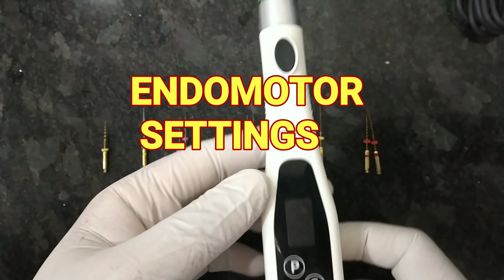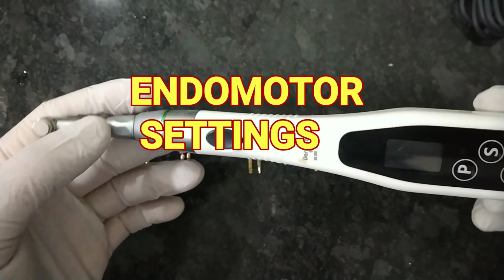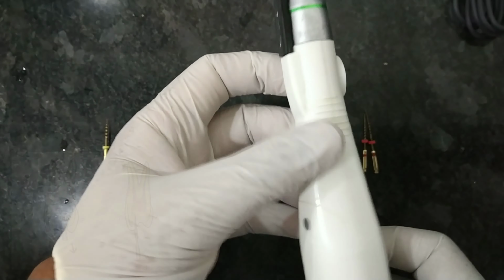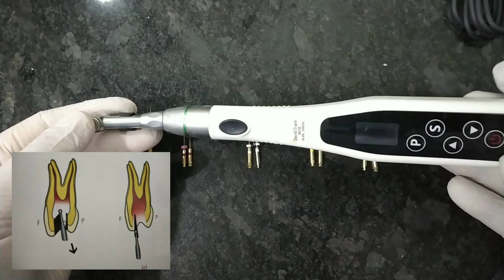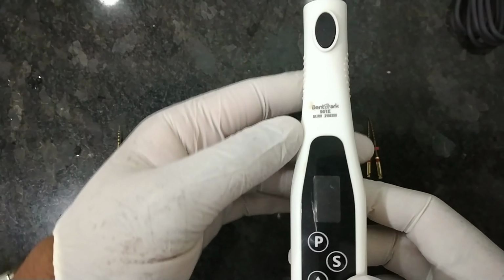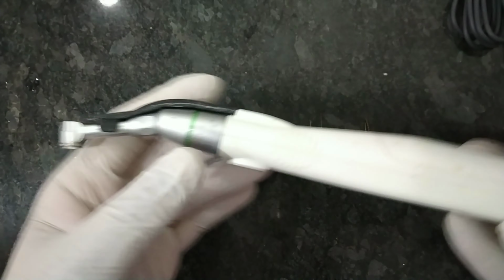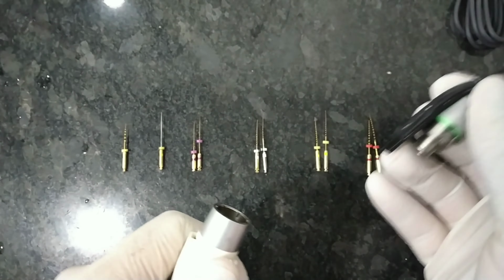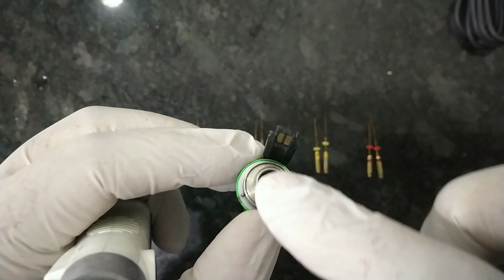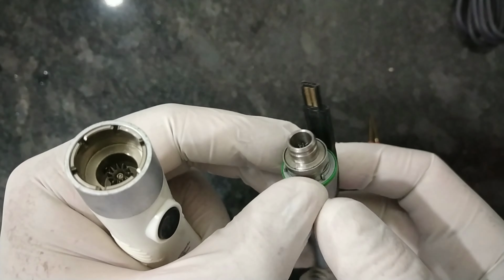So before starting rotary root canal, rotary RCT or rotary endodontics, first we should be well versed with the endomotor. So this is a basic endomotor, and the price is also very economical. Here you have the handpiece where you can attach it like this. You should oil it here, not here. It contains the battery and the motor.